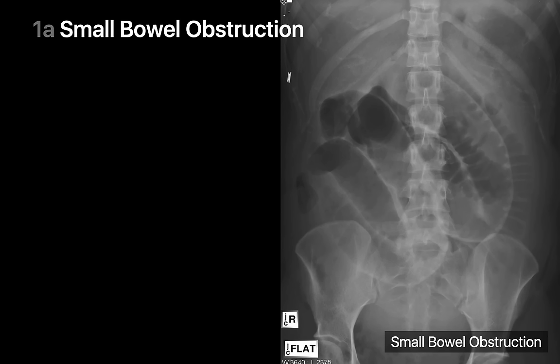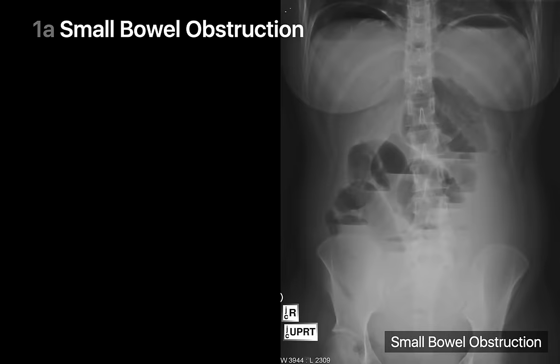On this supine x-ray, we see multiple segments of air-filled small bowel over 3 centimeters in diameter, no perceptible colonic gas or stool since the colon is probably empty and collapsed, and pronounced valvulae conniventes in the left abdomen. On the corresponding upright x-ray, we also see more than 10 small bowel air-fluid levels in dilated small bowel of various heights from the ground.